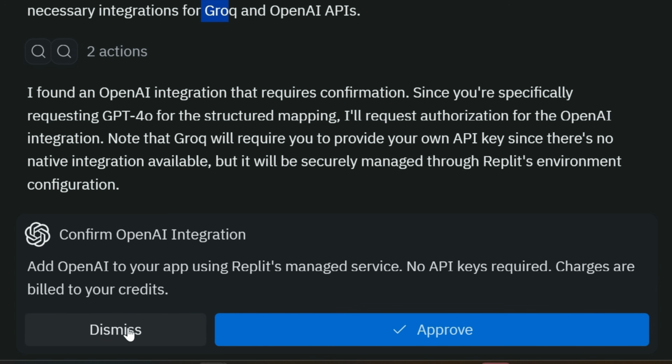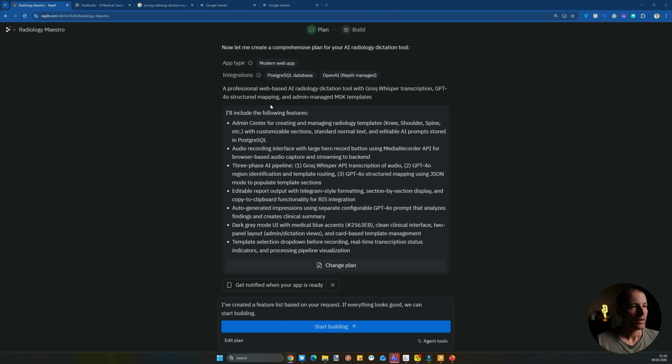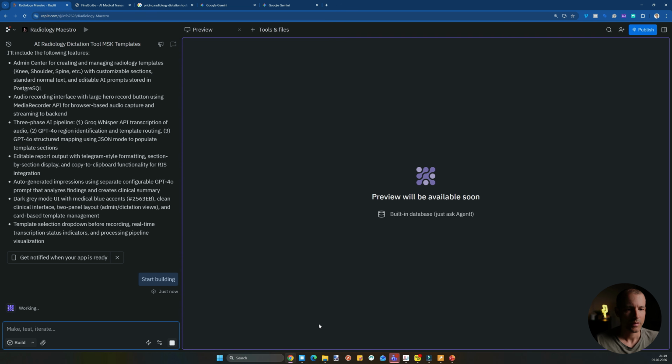You can just do this. It's probably going to be easier for you. So it's now giving us the plan: integration, database, Replit managed template. Now we will have our own key based template management. I think this is sounding good, so let's start building it. I assume it will ask us for the keys when it's ready.